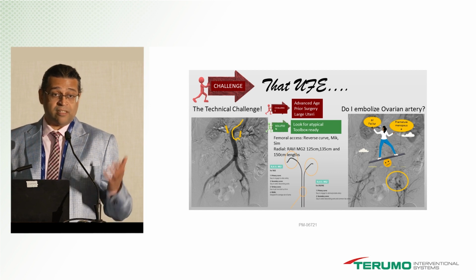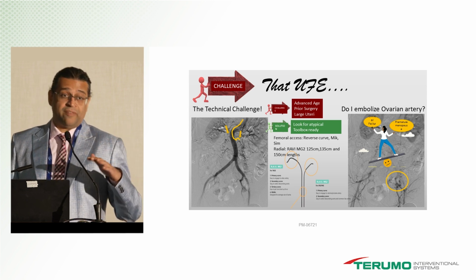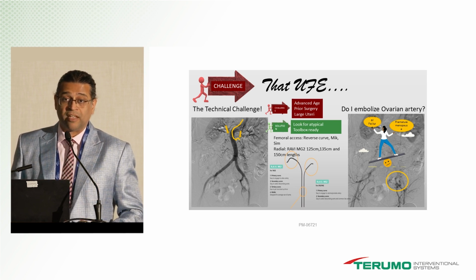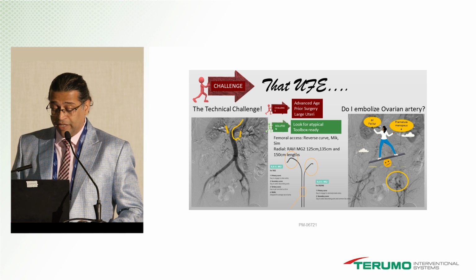The advantage with these is the curvature is very good, they're hydrophilic, okay, and they really work very well. So we've sort of gone away from the traditional Sarah catheter. We essentially use these catheters for these cannulations. So I had these catheters with me, so I decided to go in.